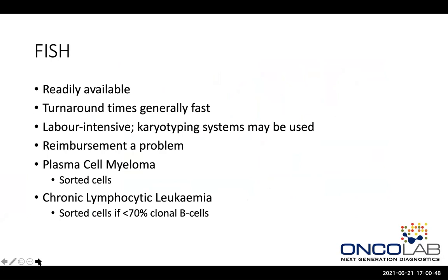FISH, just quickly, it's readily available. The turnaround times are generally fast. It's labor intensive, although some automation with karyotyping systems may be used. In the state service, reimbursement is definitely a problem, and I think I've written the most letters about this assay.